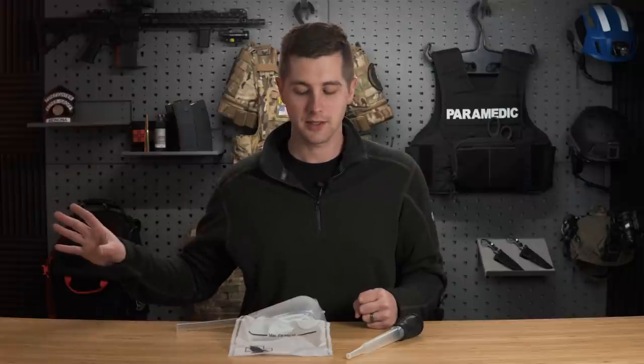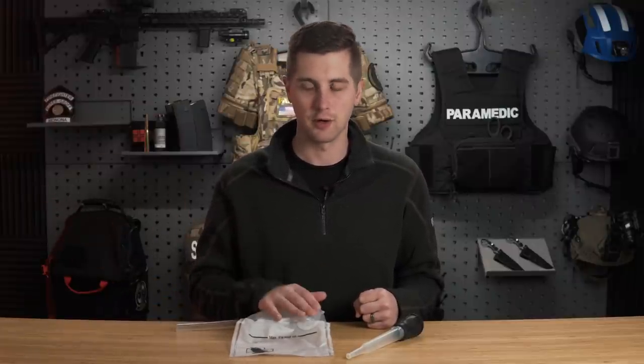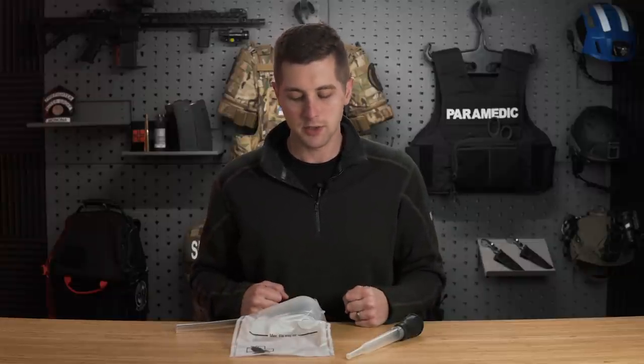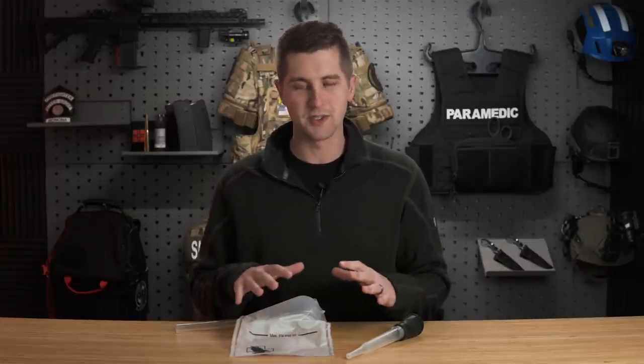Before we go any further, I want to make it crystal clear that electronic suction is the standard of care. If you have access to electronic suction and you're still using a manual device, you're doing something wrong. However, those electronic suction catheters are not always feasible for the layperson — one, they're cost-prohibited; two, they're pretty bulky and it's a low-use item for most civilians packing a car kit or a rucksack. So today I want to go through some manual options and tell you the good and the bad.